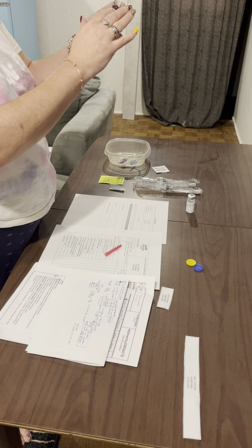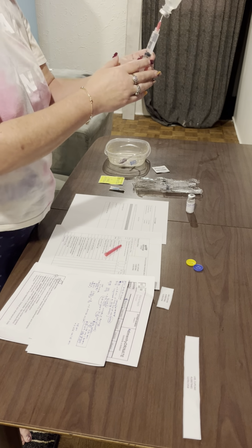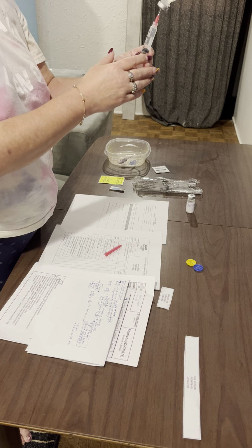Okay. And at this point, what has happened is we have a huge bubble in here. And then we have another problem, because if you can see, we have a lot of air on the top. To fix this problem, we would have to start all over again using the procedure I showed you.